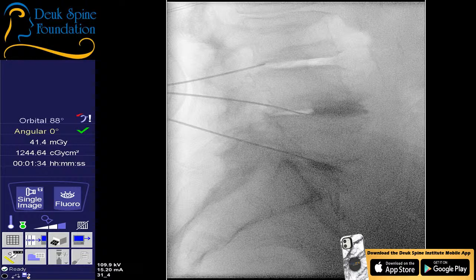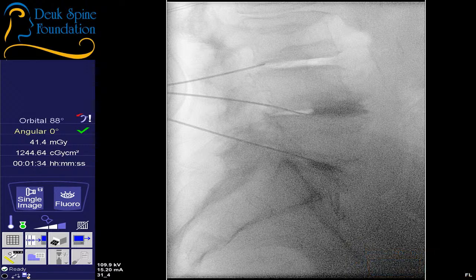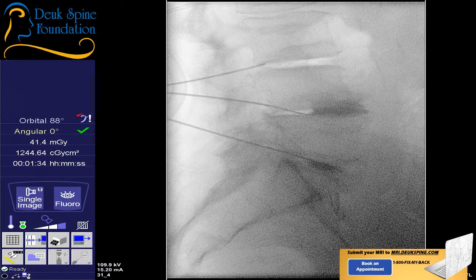Leaving the guide wire in place. The needle is a navigational tool. The guide wire is not. That's why we use the needle to navigate. It allows me some control over the direction of the needle because the surface is beveled. It's a little known fact.